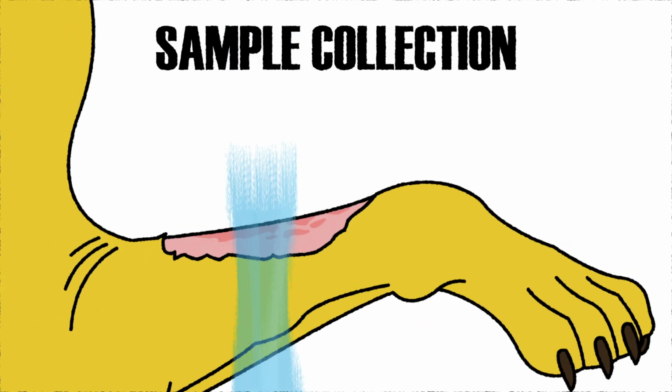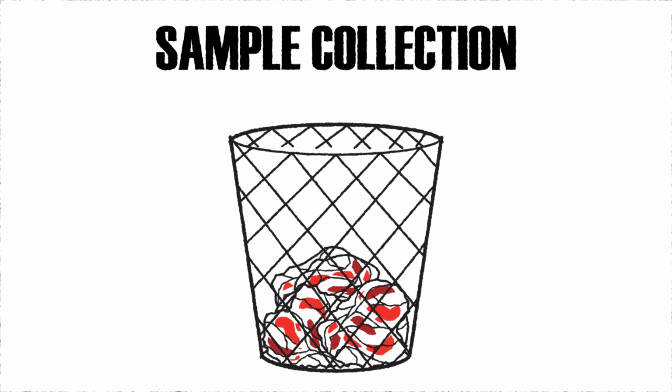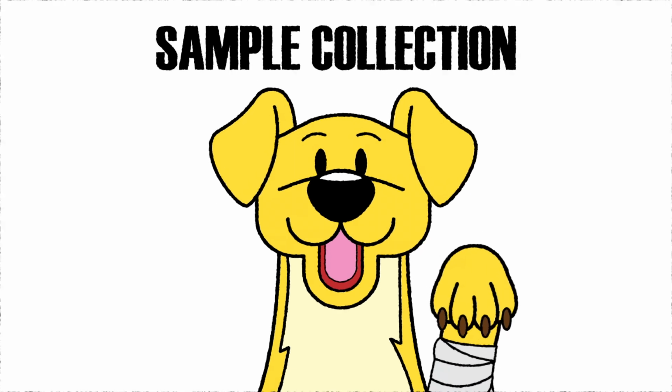For wound sample collection, clean, debride, and lavage wounds before sampling to avoid culturing surface contaminants. Remember, don't culture what ends up in the trash. Culture what is left behind in the wound. That's what you want to treat.